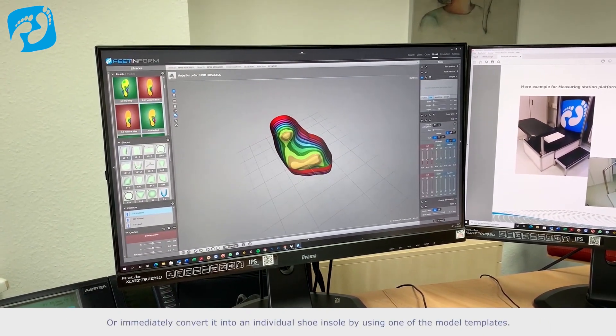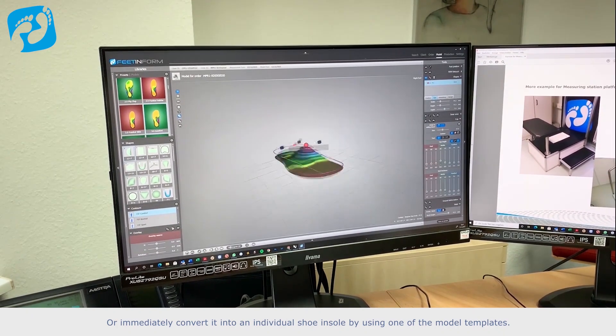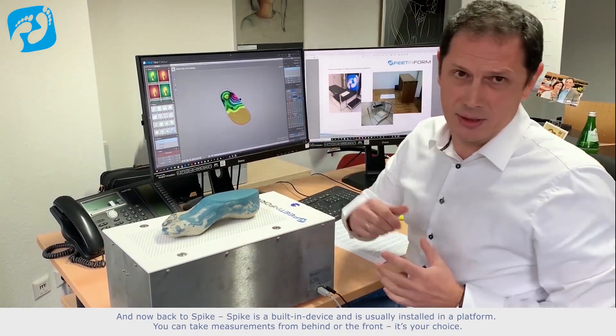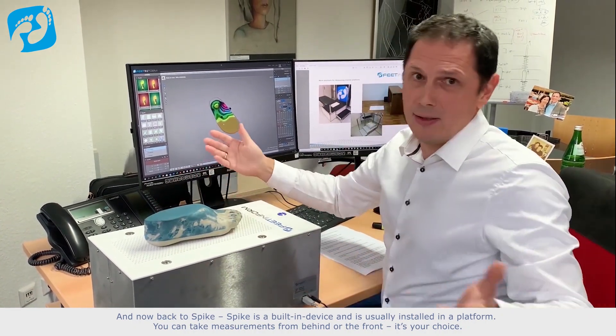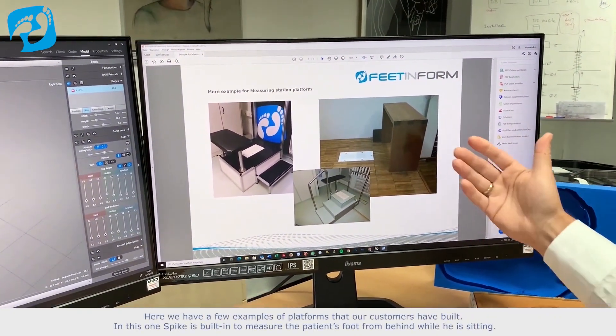Or immediately convert it into an individual shoe insole by using one of the model templates. And now back to Spike. Spike is a built-in device and is usually installed in a platform. You can take measurements from behind or the front — it's your choice. Here we have a few examples of platforms that our customers have built.